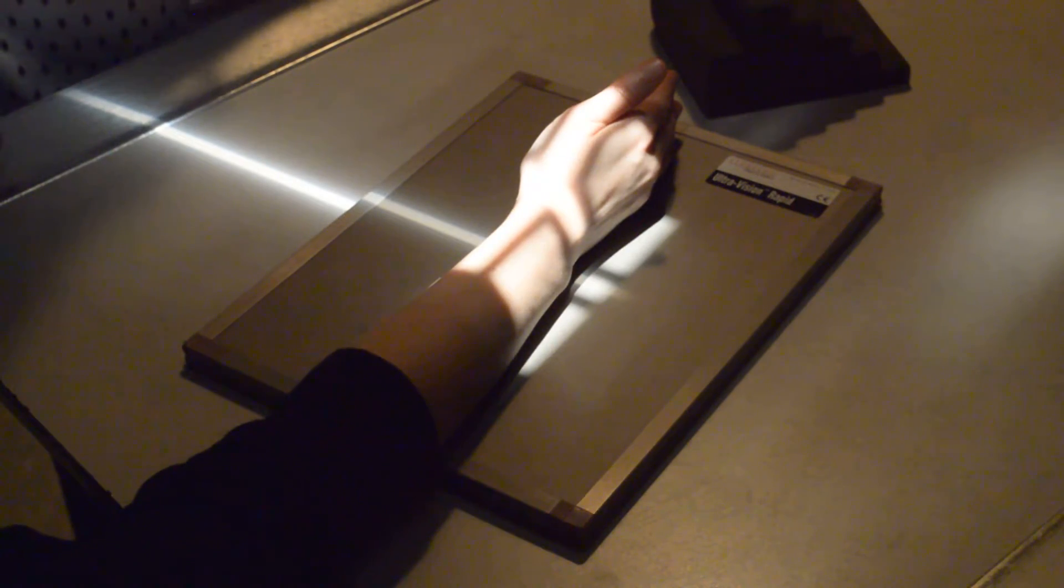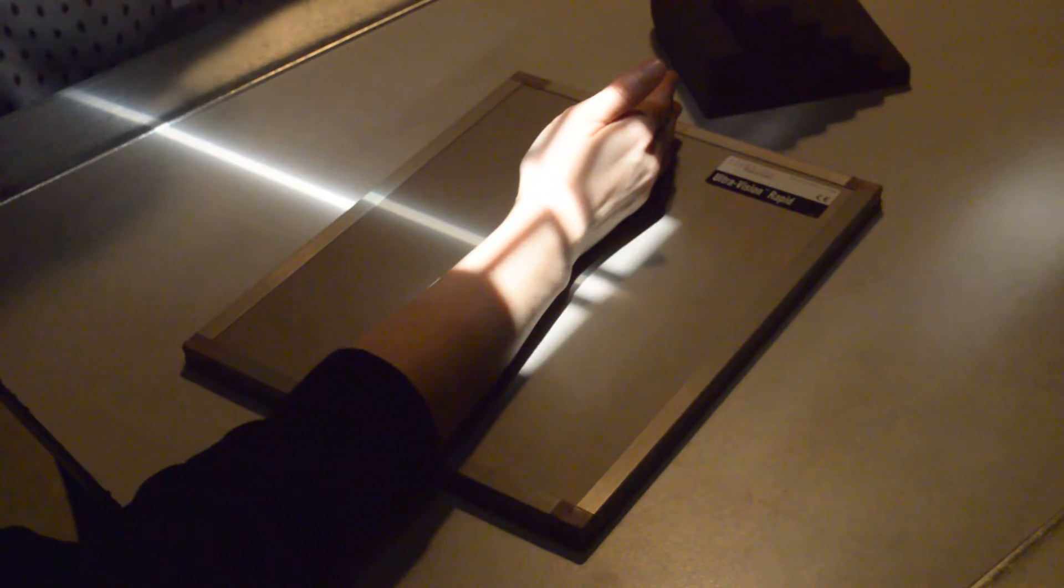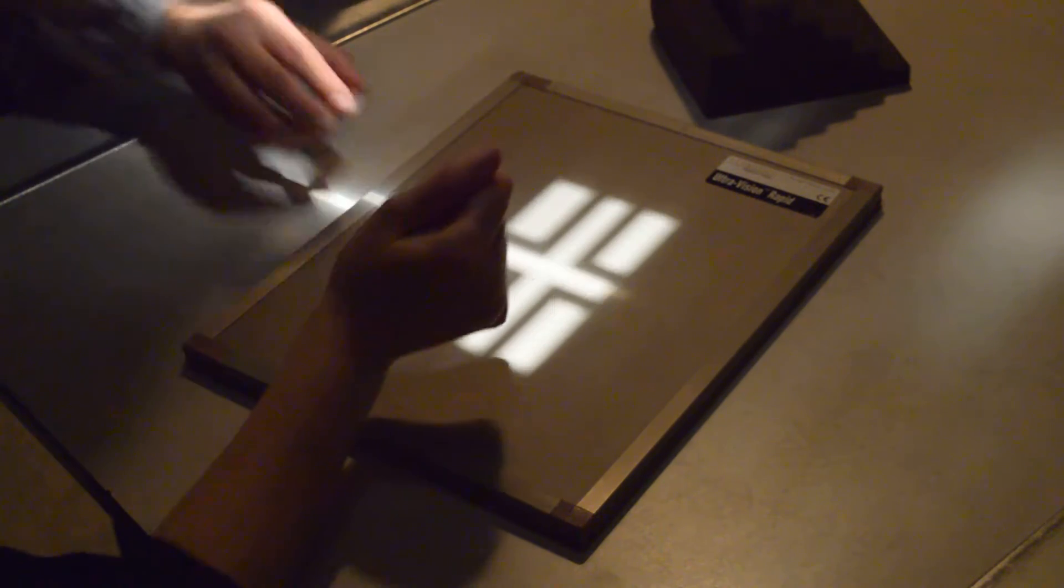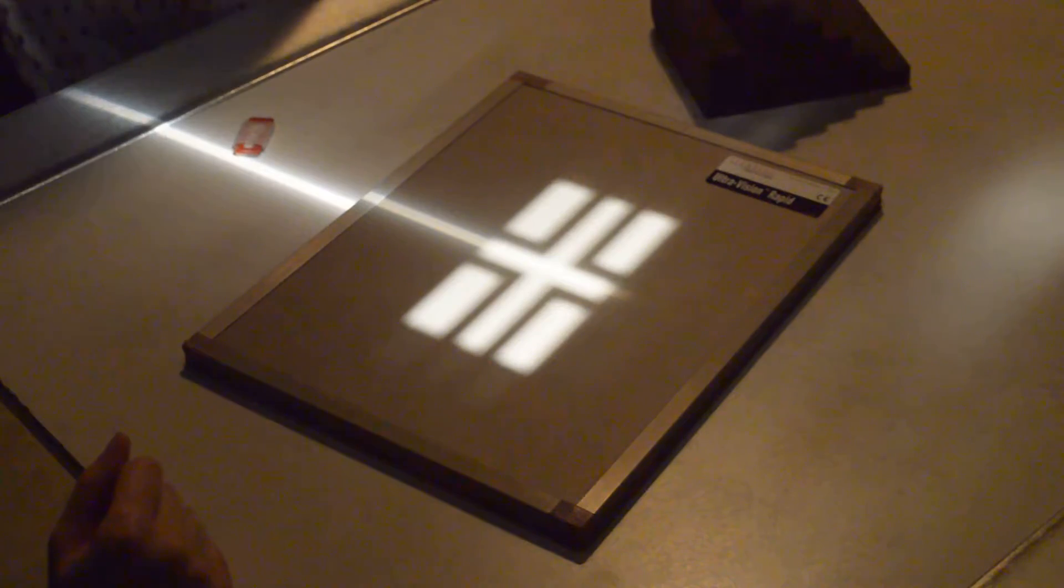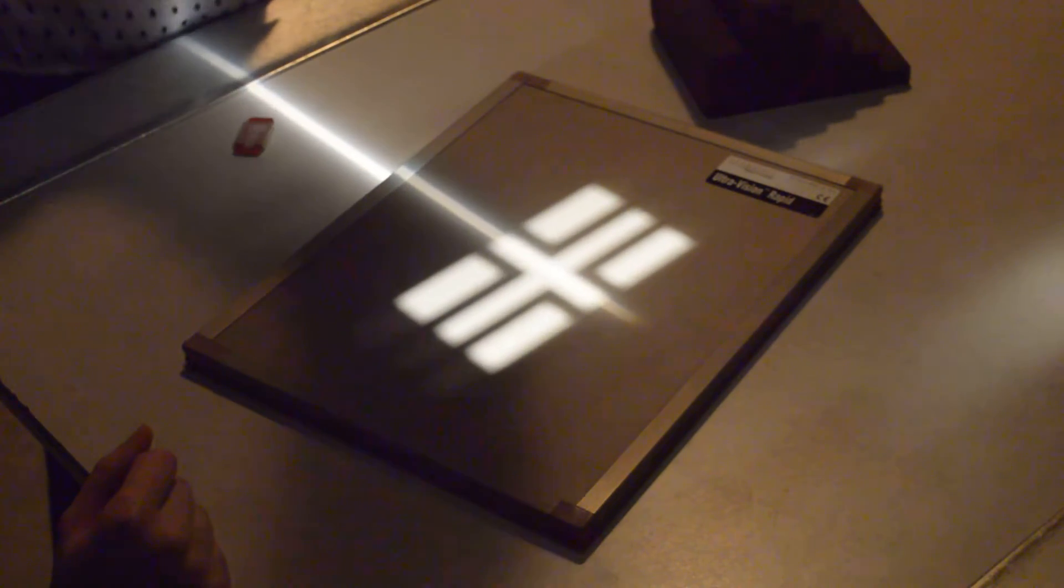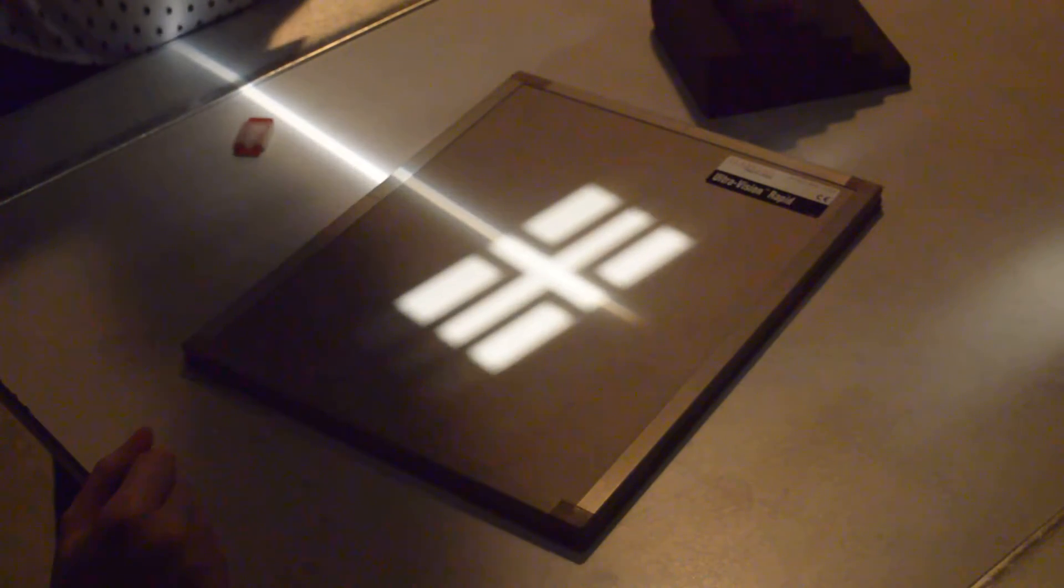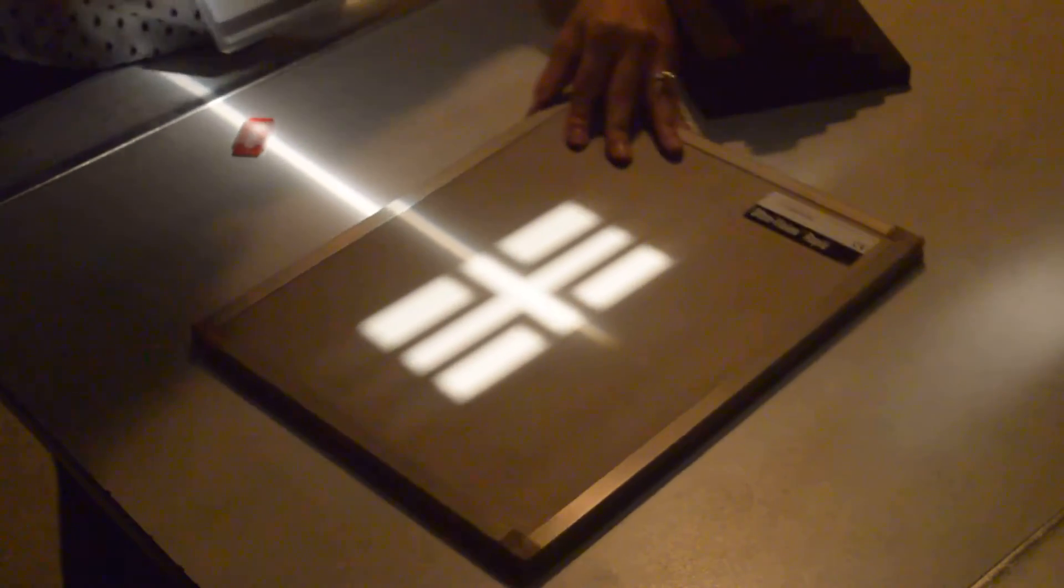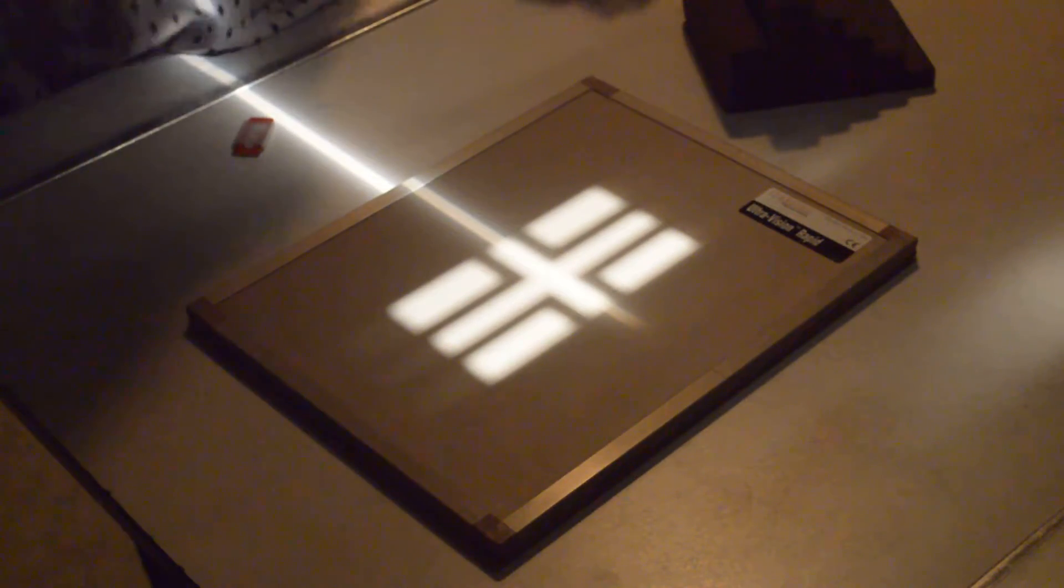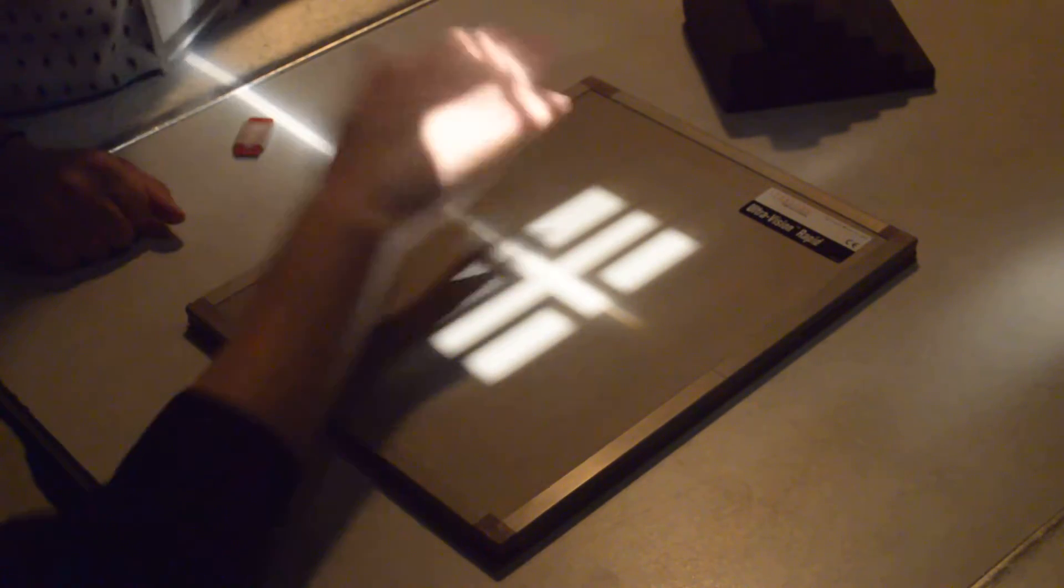And then the last one that you guys are going to do for the wrist is going to be the ulnar deviation with a 10 to 15 degree tube tilt. So you're going to tilt your tube along the long axis of their arm. So I'll just start by doing that. Have your patient put their hand down so that they're in the PA position. I'm going to have Libby move her pinky towards her ulna. So that's going to be your ulnar deviation.